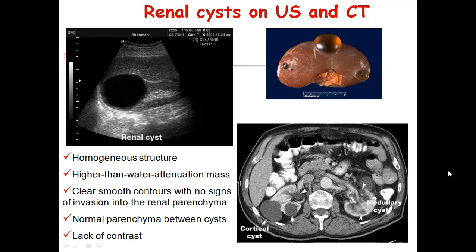Radiological features of renal cyst, what may we find on CT and ultrasound images are the following.